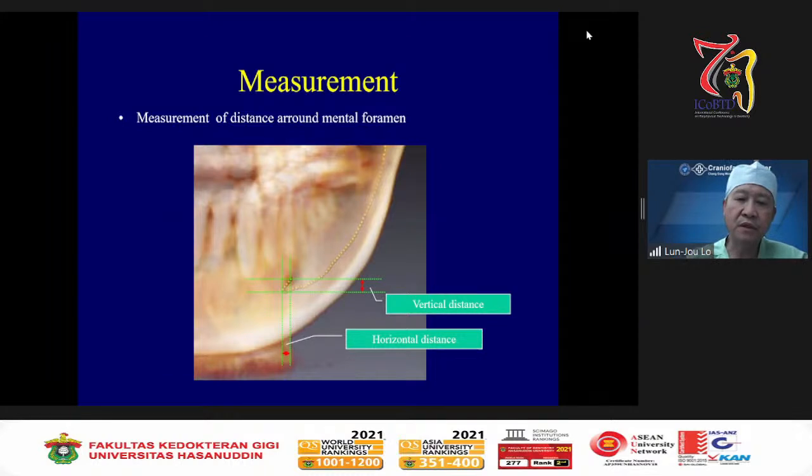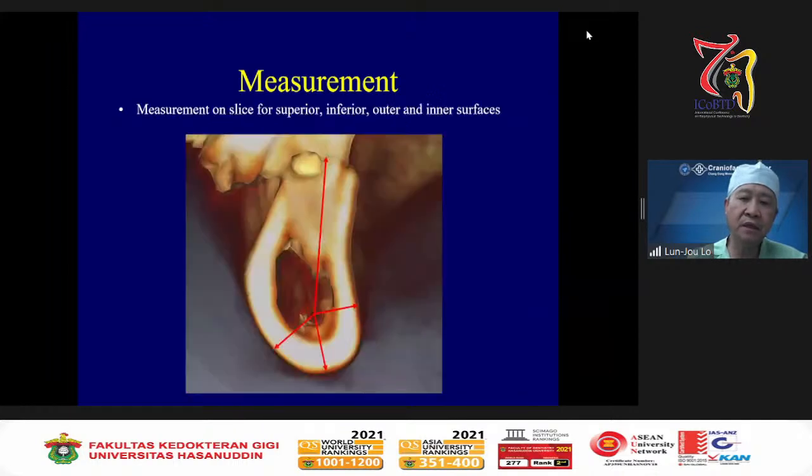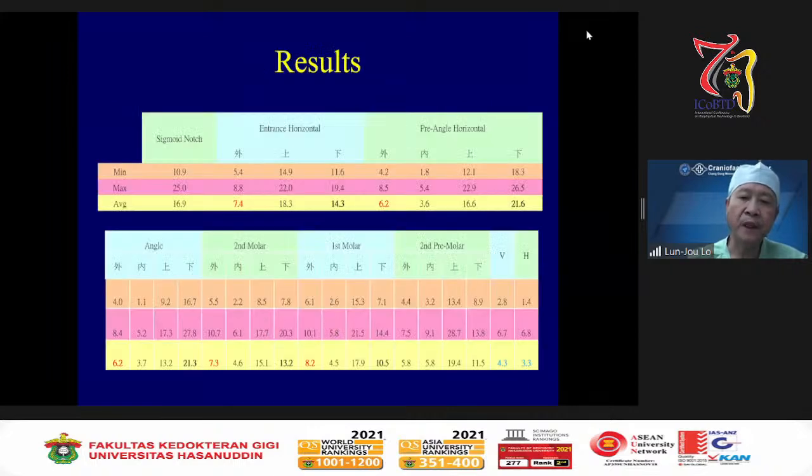exit of the inferior alveolar nerve into the mental nerve, because the nerve always goes inferior, anterior, and then comes out from the mental foramen. So if you do genioplasty, you need to avoid injuring the nerve. This kind of measurement can give you a very nice anatomical relationship before the surgery, when you do the planning, and actually during the surgery, you can see the data from it.